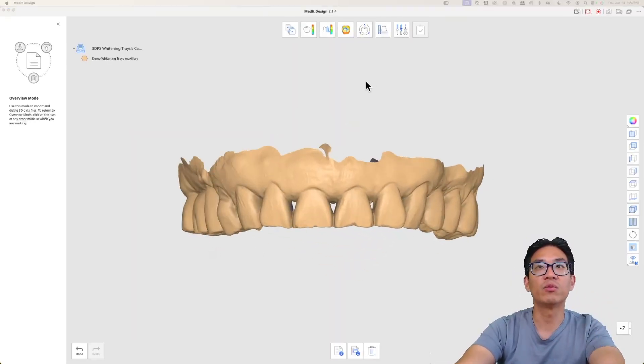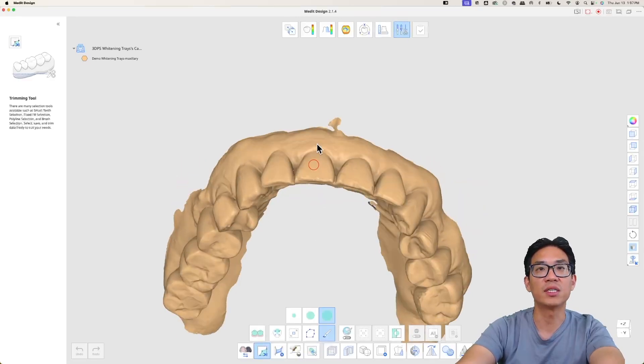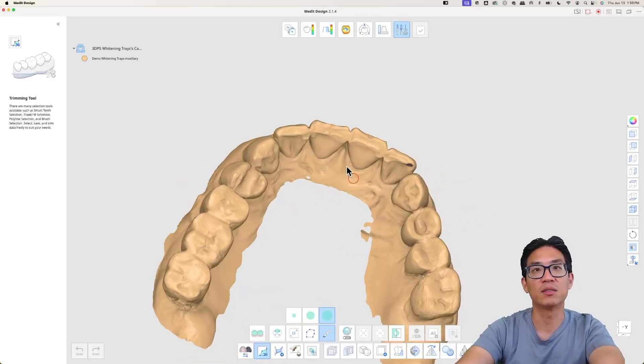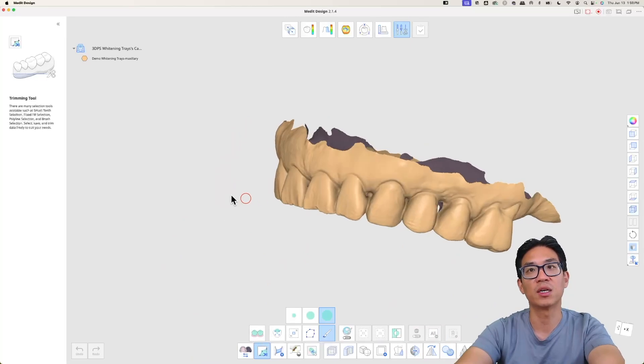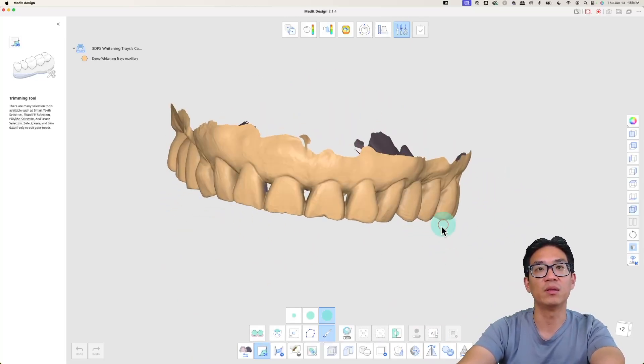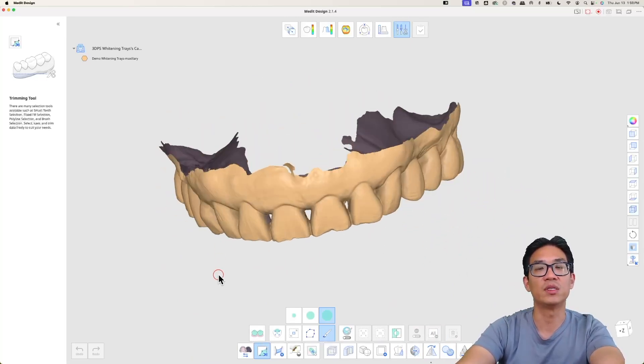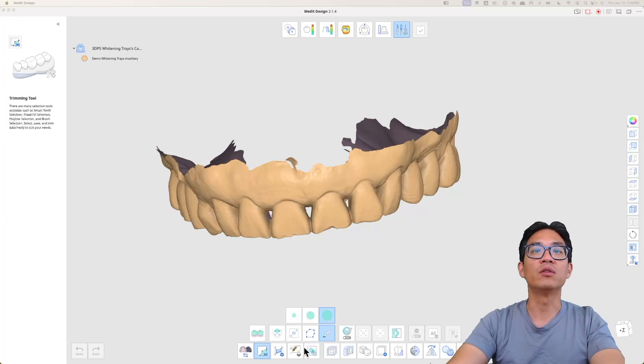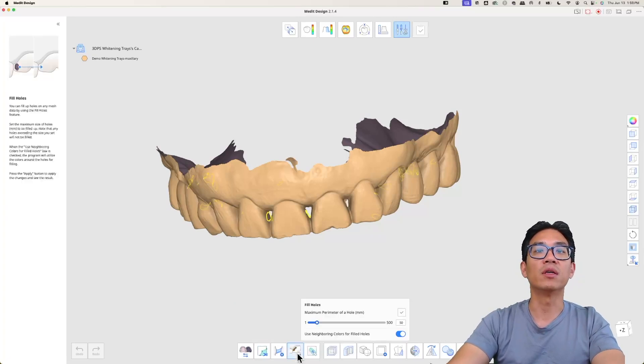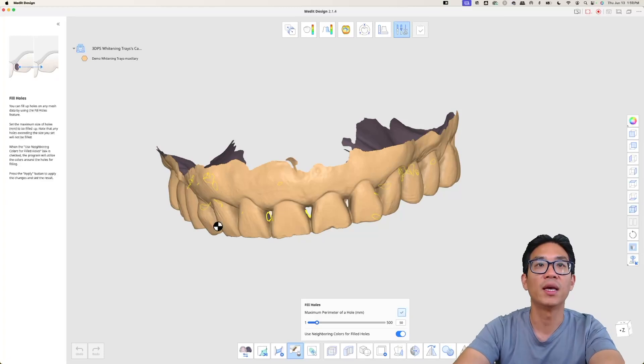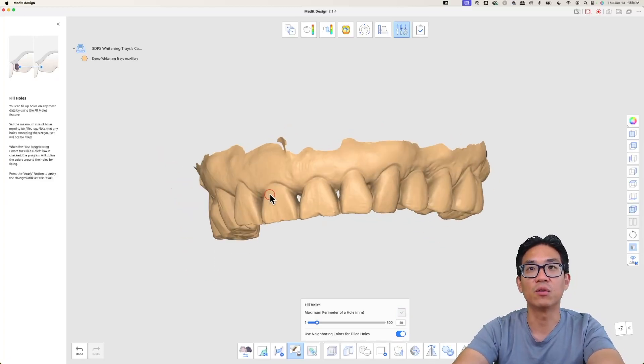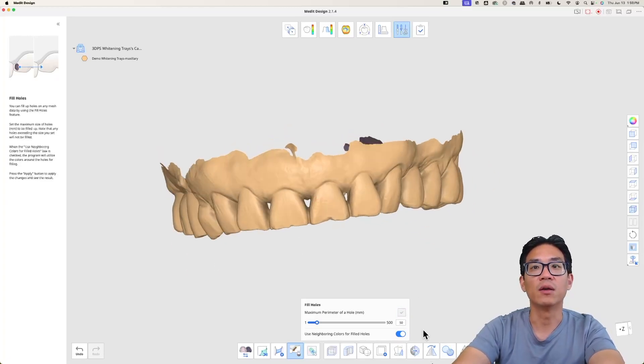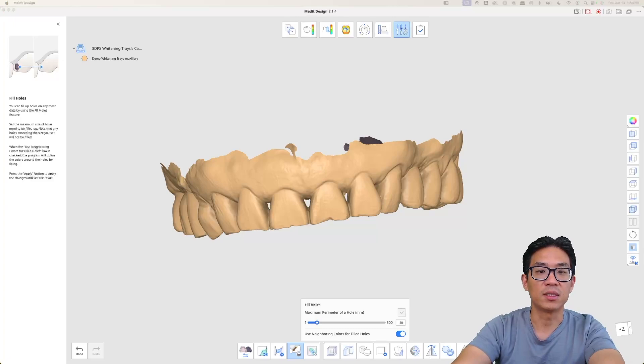First we want to repair the scan. Sometimes a lot of these scans might have some holes which can kind of mess up the design process. What you want to do is go down here and click this fill holes button and then just hit apply, and then all these yellow circles where the holes were goes away. Easy as that.